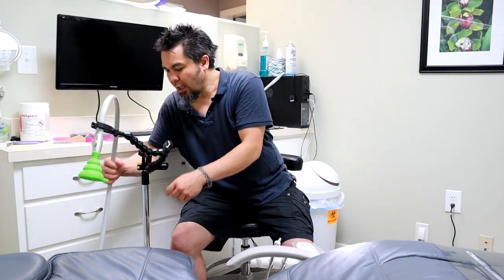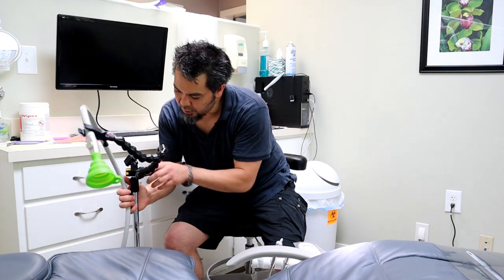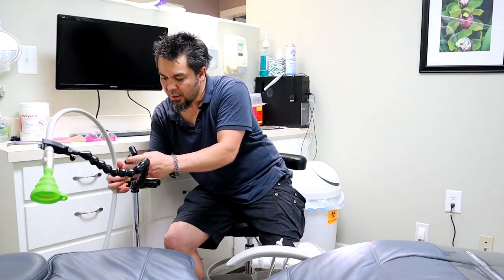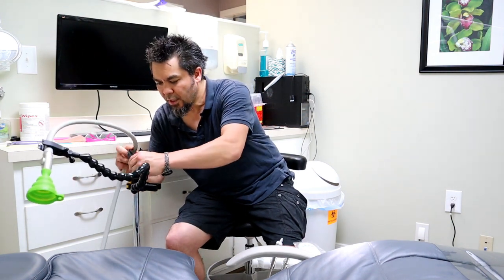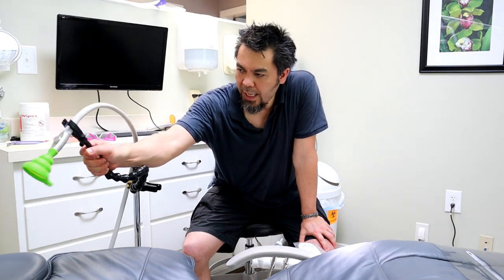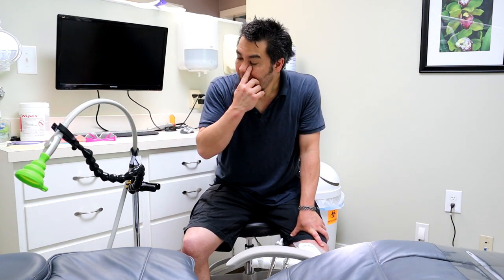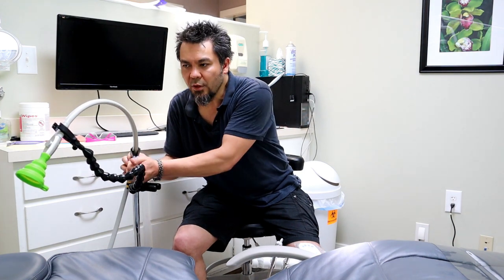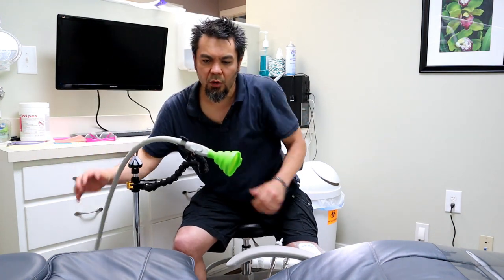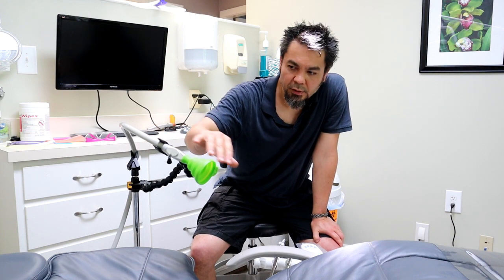It works a lot better if you also grab the hose in the microphone clip on the mic stand. You have the PLAMP holding the end, and the clip takes the weight off the PLAMP so it's not holding the whole weight of the hose. Sometimes the weight of the hose will cause this joint right here to twist if there's too much weight on it. The microphone clip takes some of that weight off and makes it easier to keep the PLAMP holding the hose in the proper place.